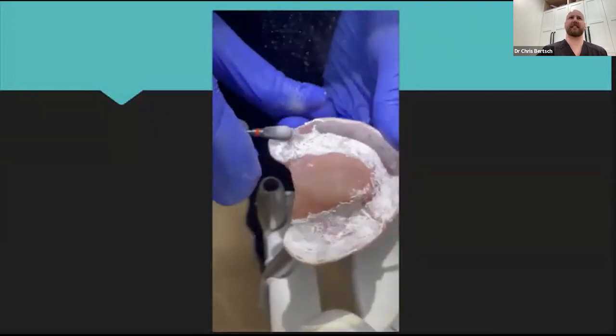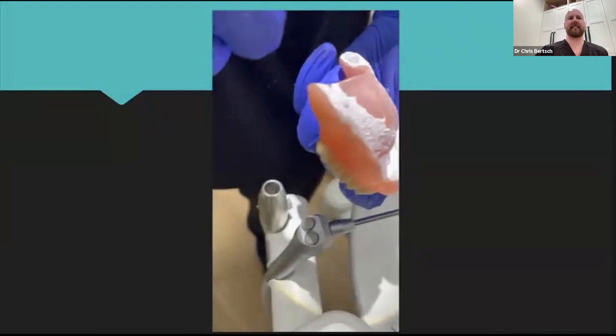I used to do temporary relines like Lynal at different stages through the healing, but I had so many issues because patients wouldn't keep it moist. They would just get gross with food. So now what I do is I just tell them to go buy Poligrip and use that. They complain about how much they have to use and all that, but by constantly reminding them that that's what they're going to need to do, I don't really have an issue with it, to be honest. And then, like I said, we have them booked for that 3-month follow-up, and 3 months comes so fast. It's crazy. I can't believe it's already that time.